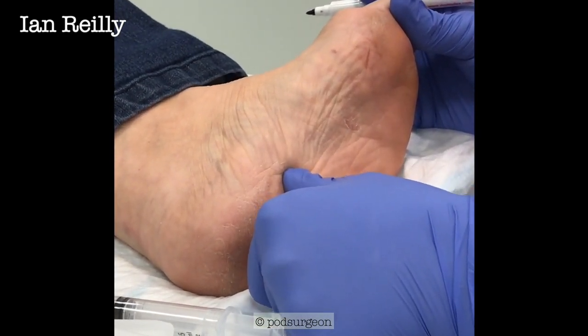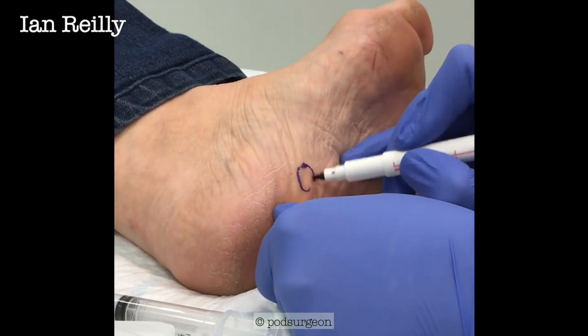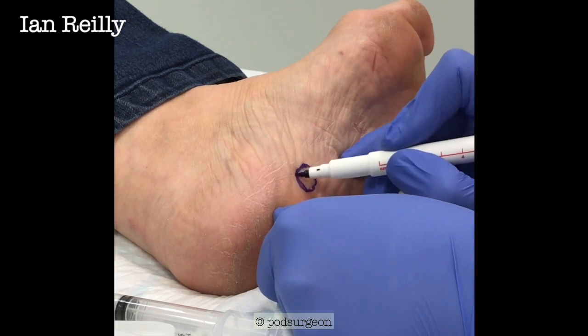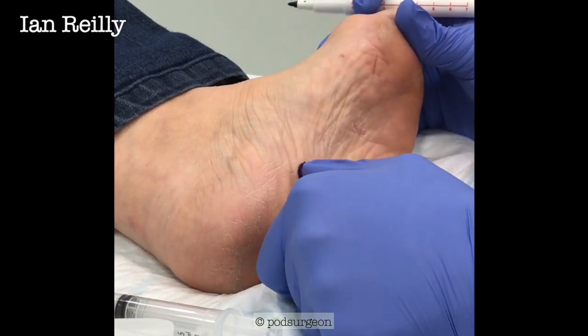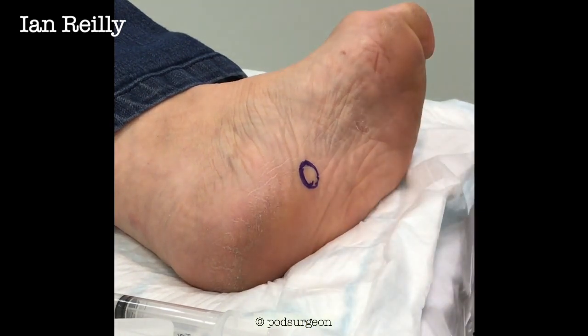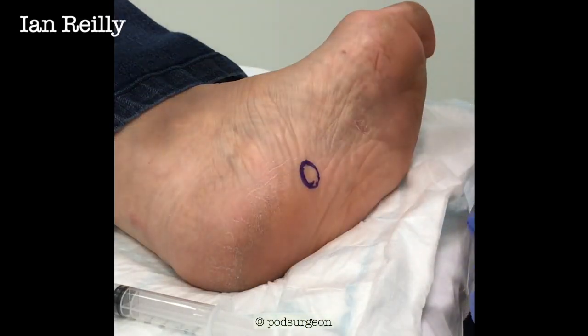A little bit sore, but so much better than it was. So we're going to do another injection today, really get this to shrink down. So that's our lesion just there. And we're going to re-scan you after this so we can really see the difference in size.